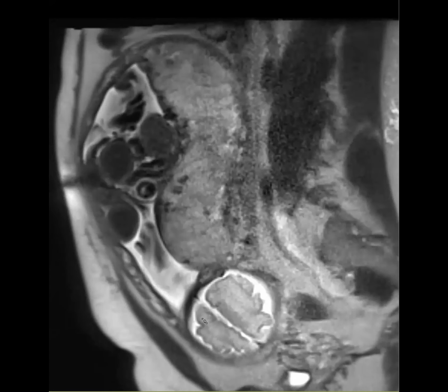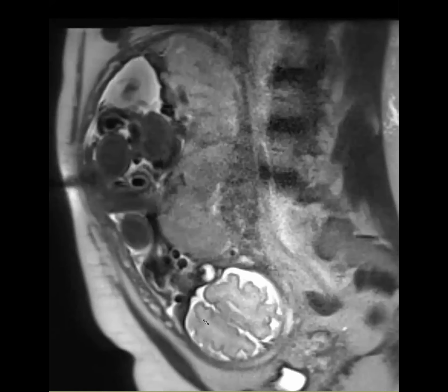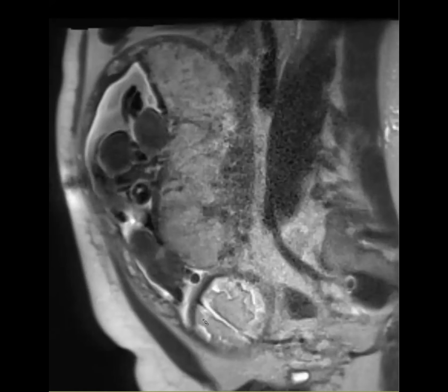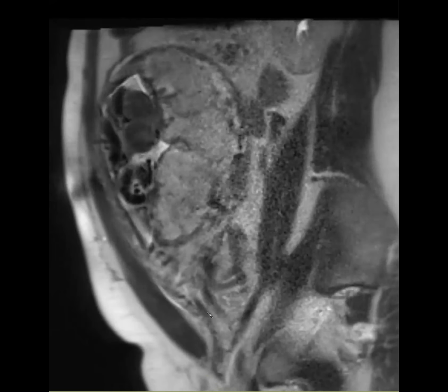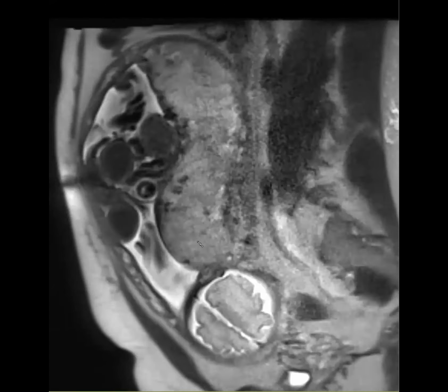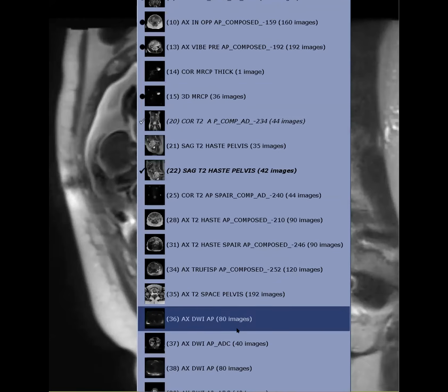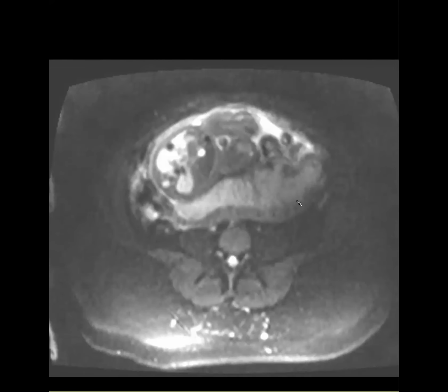I know this is not the highest resolution, but a couple of things that I didn't really see are some of the things that we look for: T2 hypointense bands and then large irregular vessels. I thought these were the normal kind of bands in the placenta, and I didn't see any definite large abnormal vessels. One area where I thought we could see the placental myometrial interface better was possibly on this diffusion, where this was mainly the placenta and this is mainly the myometrium.